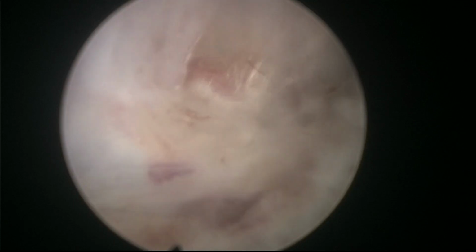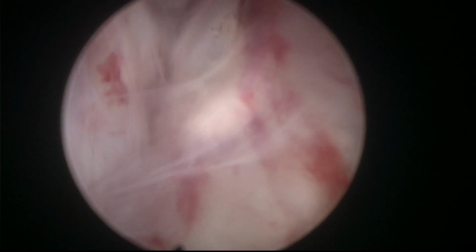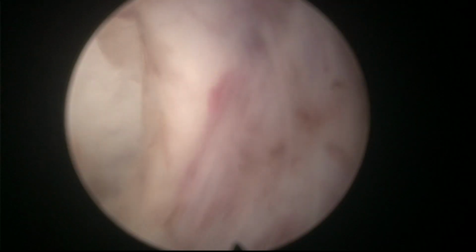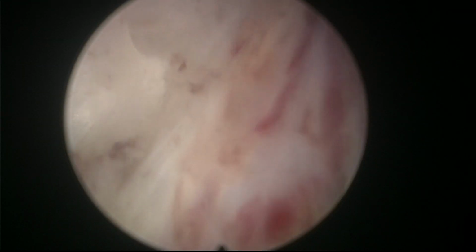Now I'm working to try to do a uniform anterior line of dissection, to get a uniform line that will connect to the lateral line of dissection. Progressing nicely and carefully, very nice. Here we are connecting with the anterior plane of dissection. We have to check if we're achieving a similar thing on the other side in a moment.